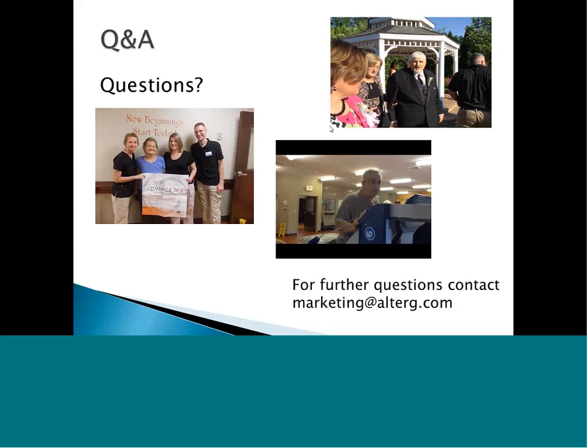Once the shorts come on, if it's a low-functioning patient, use 2 people to help them either sidestep onto the AlterG or put the tub transfer bench with 2 of the legs inside the AlterG and 2 out, just like you would do for a tub transfer. Sit the person down onto the tub transfer bench, swing their legs over, and then once they swing their legs over, have 2 people stand the person up.